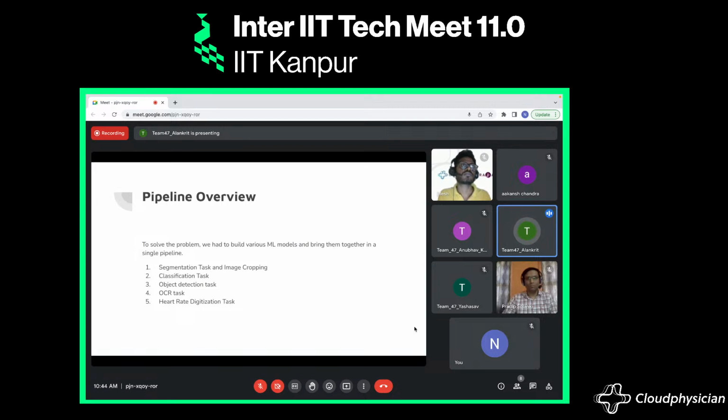the image screens, and then we applied classification to detect which screen it was. Then using object detection, we detected the regions of interest, like where the heart rate is written and where the graphs are. And further, we digitized the heart rate for brownie points also.